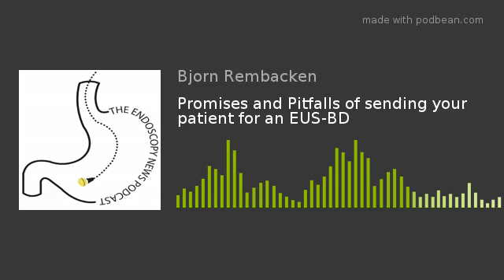We do very occasionally, in very highly selected patients, perform these procedures on patients with benign disease. So, an example of that would be a patient with chronic pancreatitis with significant variceal disease in the abdomen, benign biliary stricturing and duodenal stenosis, who presents with severe jaundice and maybe cholangitis, in whom an operation is never going to be possible.